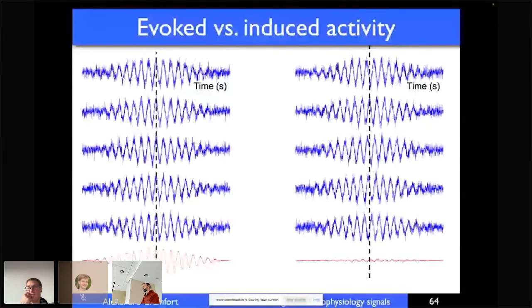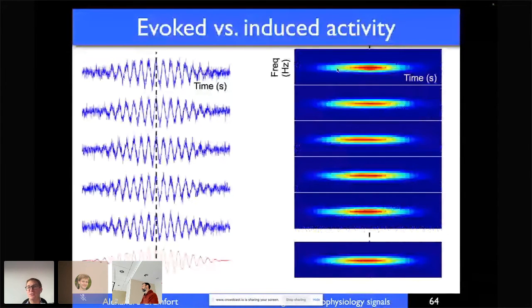Typically, people compute a spectrogram of each trial and then average the spectrograms, killing the phase and the small temporal jitter in order to obtain a clean image. This is not decoding, this is just standard time frequency analysis in the MEG, EEG world.